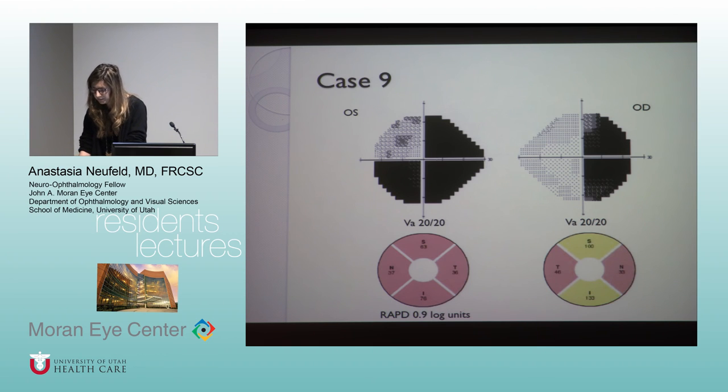we see. So again, take this one step at a time. What is the flavor of this visual field deficit? Or where's the biggest abnormality in this visual field? Right. Very good. So right homonymous, right? Right homonymous, and I need at least one more qualifier there.